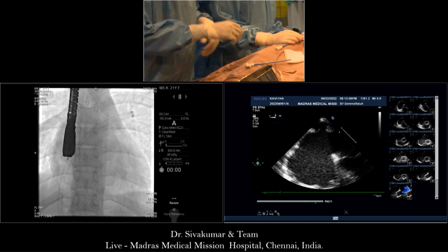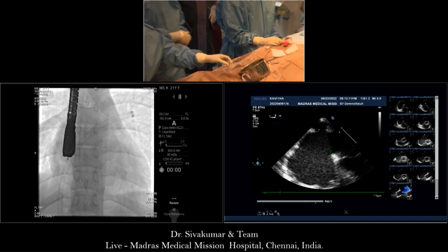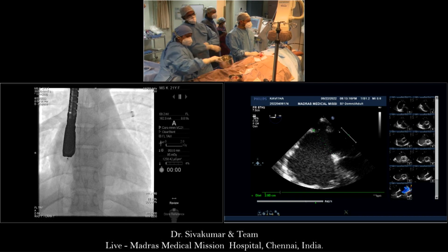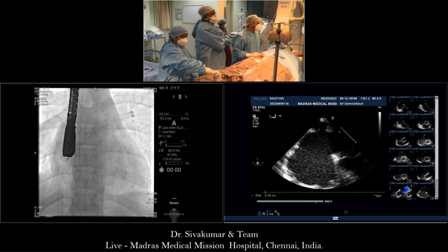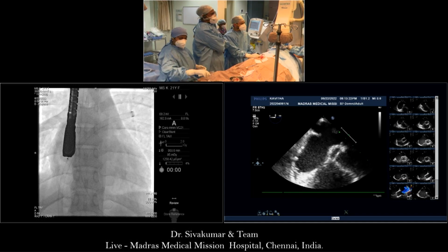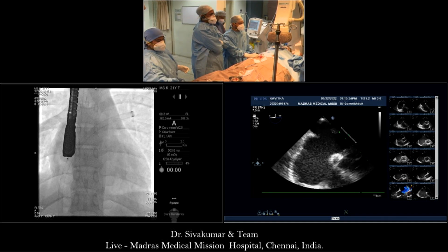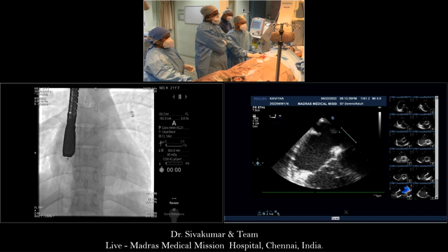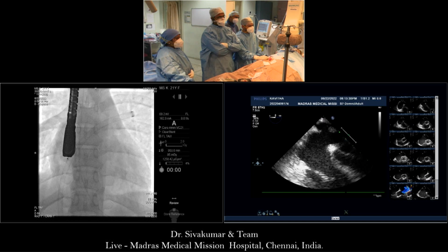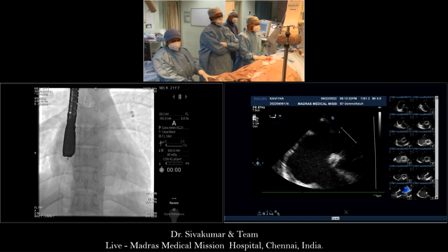Online question. One of the questions is by Ong Sabli: a bald aorta rim is very risky for erosion. The erosion expert is here. This is the bald aorta, and this is the maximum dimension, Shiva, 31. You have a very high risk factor reported for erosion with a totally bald and retroaortic margin. I would say, to minimize the size of the device.